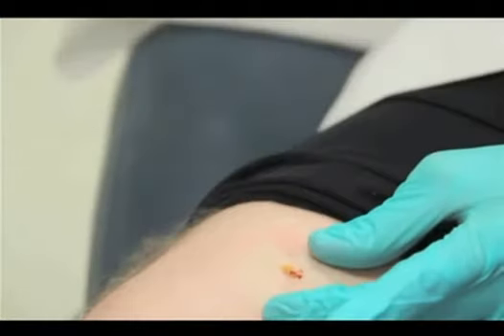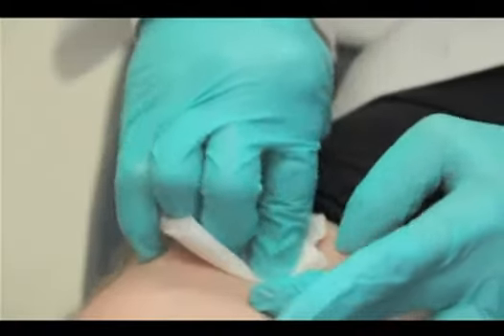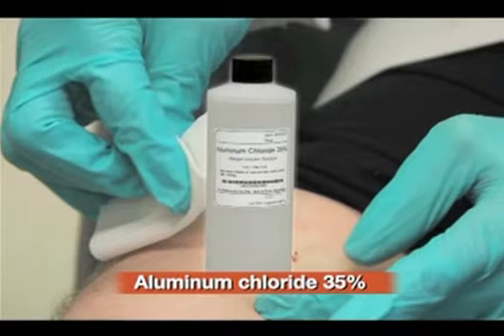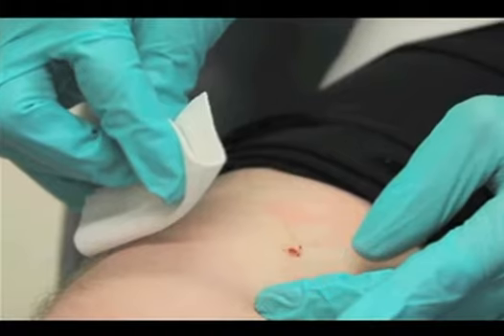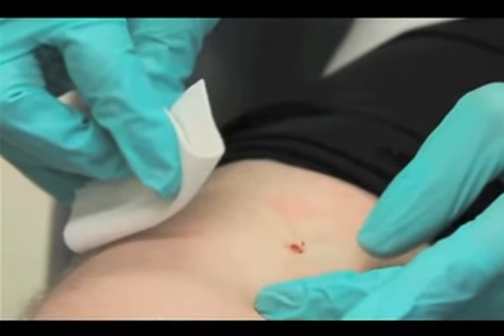Although Monsel's solution is an excellent hemostatic agent, it may tattoo the skin. Thus, some practitioners prefer aluminum chloride to achieve hemostasis. For small punch biopsies, the aesthetic outcome can be satisfactory to excellent when the wound is left to heal by secondary intention, that is, healing without suturing.